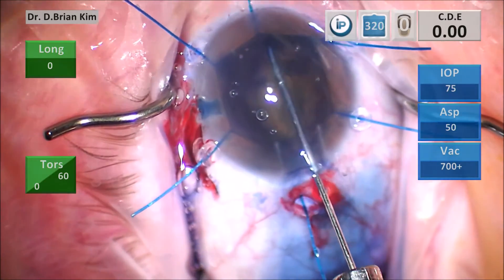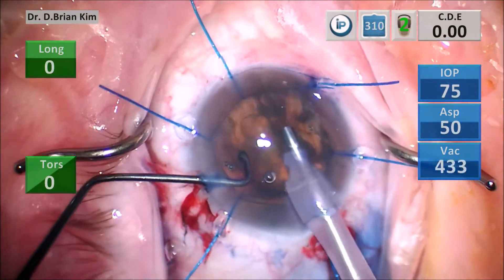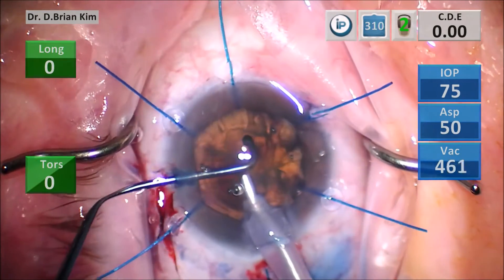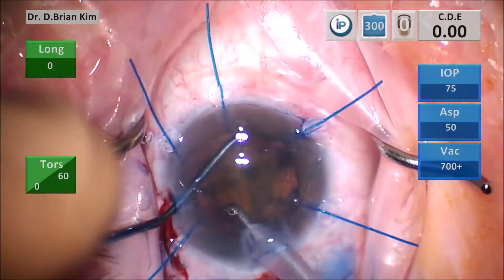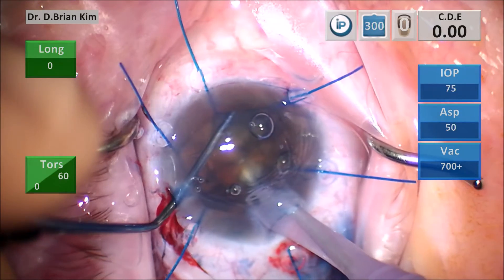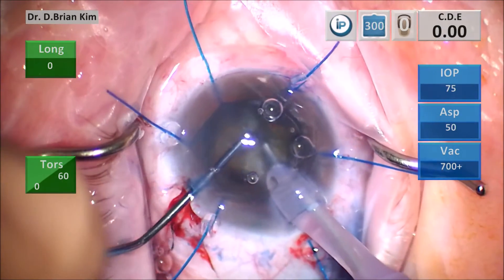I performed my one-step hydrodissection technique and proceeded with my double chop and cross chop maneuver, making sure I don't utilize any ultrasound or vacuum during the chopping maneuvers. I placed the chopper out to the equator, placed the phaco tip incisionally, and fractured the lens using diagonal forces.